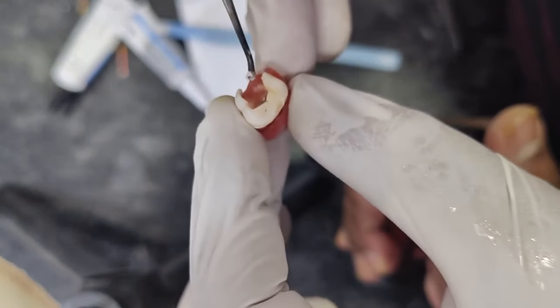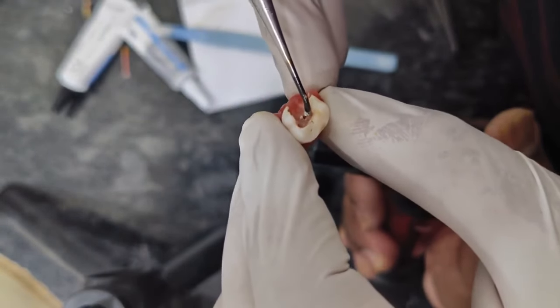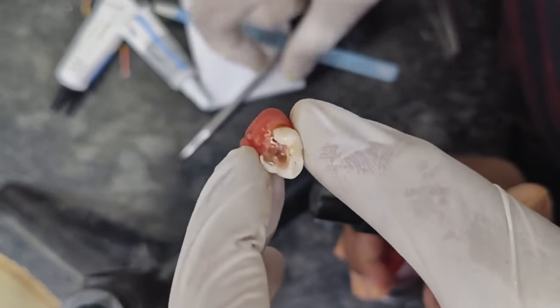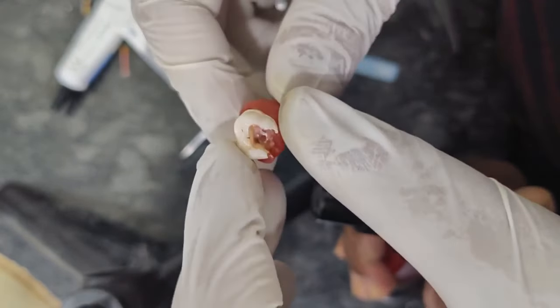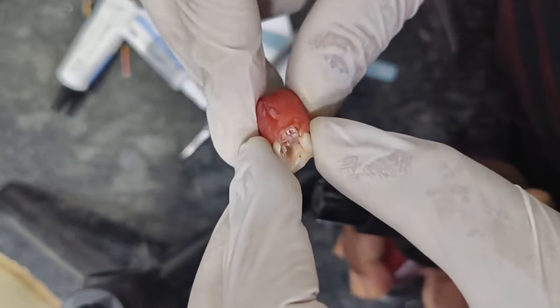Now you can fill this tooth with composite or glass ionomer cement, and then wait for 3-4 days or a week before giving the crown of the tooth. So in this way, we finish with the root canal of the upper molar teeth.